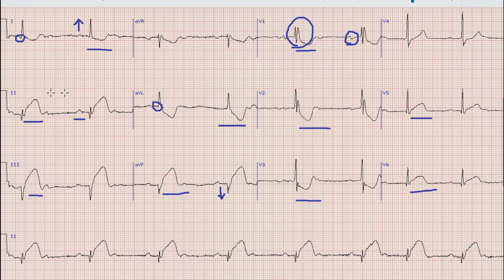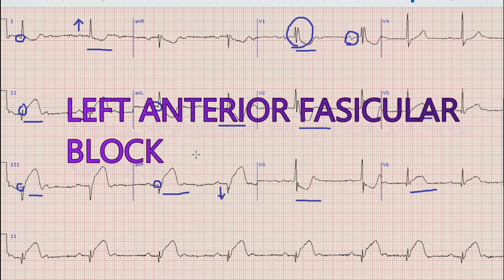In lead 1 and aVL there are Q-waves and tall R-waves, while in leads 2, 3, and aVF there are minuscule R-waves with deep S-waves. As you know from our previous videos, whenever you find a small Q with a prominent R in lead 1 and aVL, and a small R with a deep S in leads 2, 3, and aVF, it means that there is left anterior fascicular block.